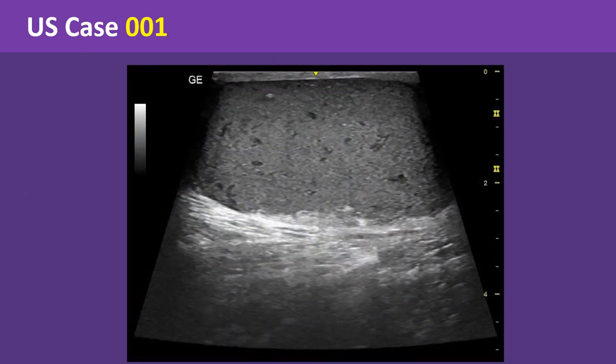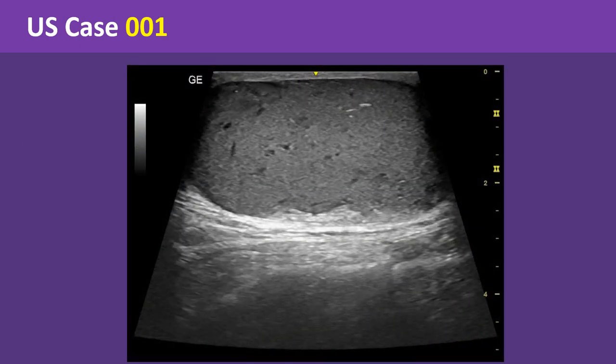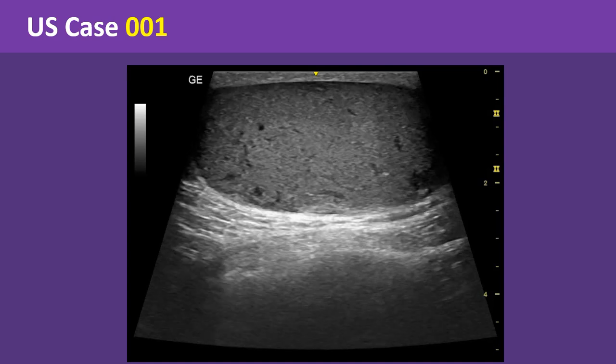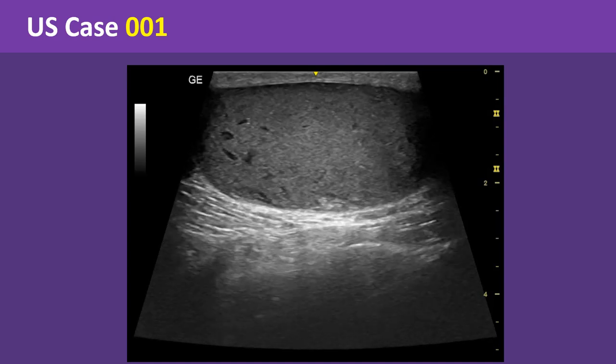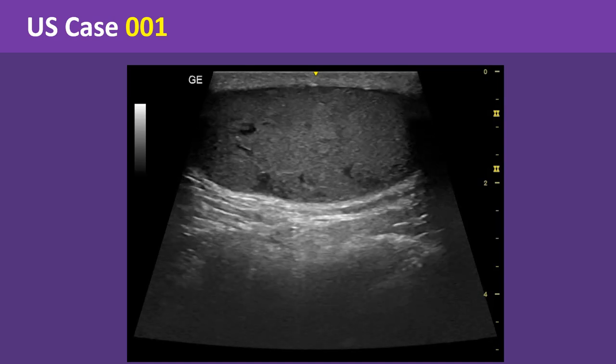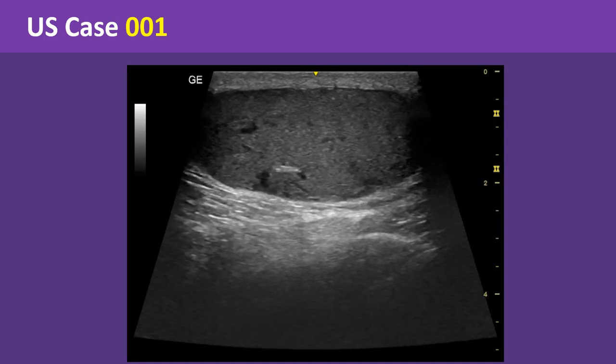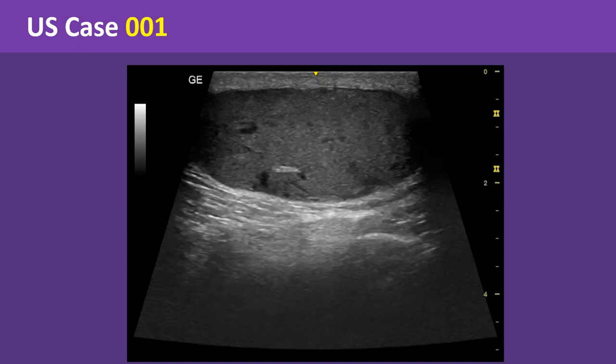This is a video clip of ultrasound scanning of the swelling. Look carefully at the clip and images, then try to identify what is the diagnosis.